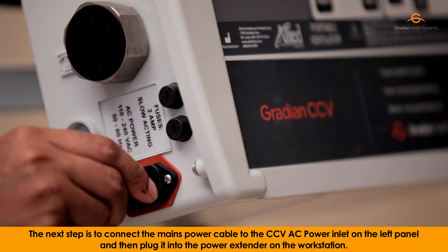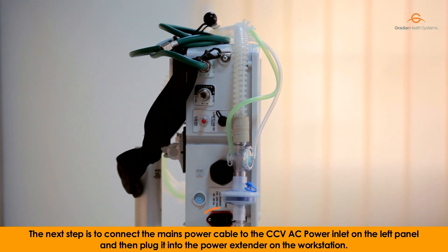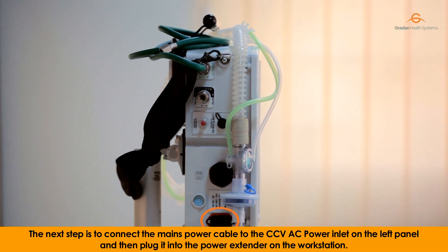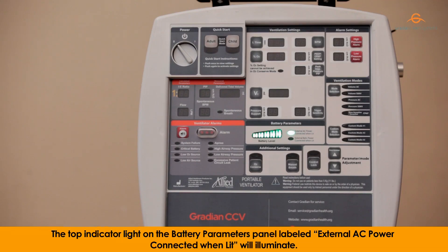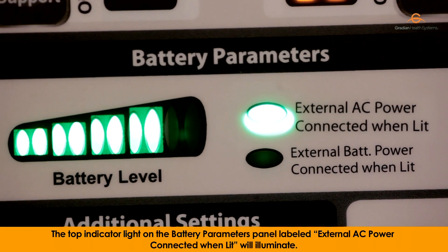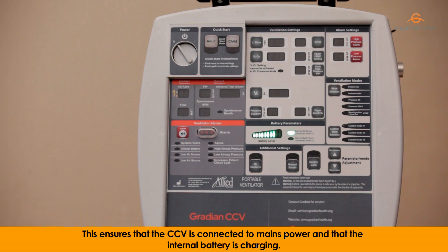The next step is to connect the mains power cable to the CCV AC power inlet on the left panel, and then plug it into the power extender on the workstation. The top indicator light on the battery parameters panel, labeled 'external AC power connected when lit,' will illuminate, ensuring the CCV is connected to mains power and that the internal battery is charging.